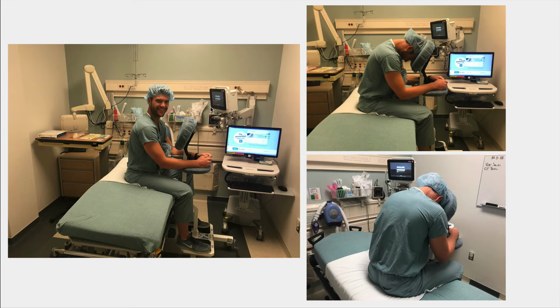So this is Tyler. He's a wonderful visiting medical student from my home institution, the University of Arizona. And he's helping us demonstrate patient placement. So you'll have him sit on the side of the bed. The massage chair will be here.